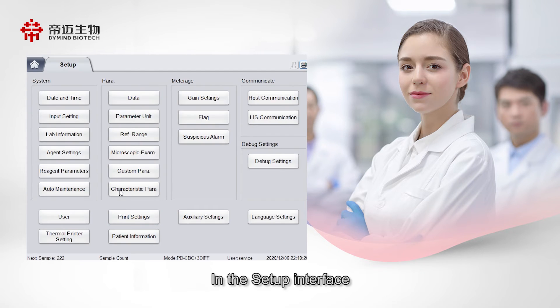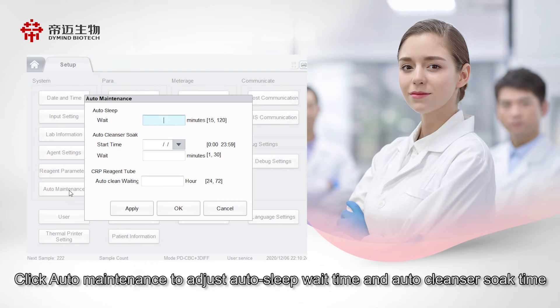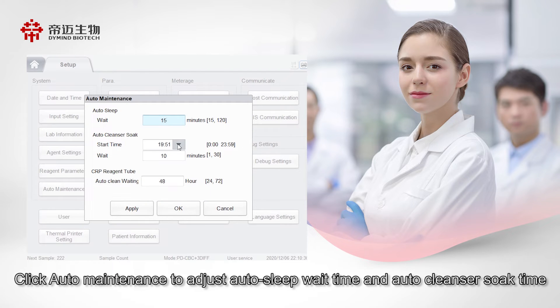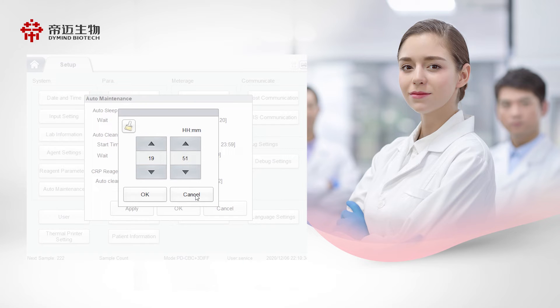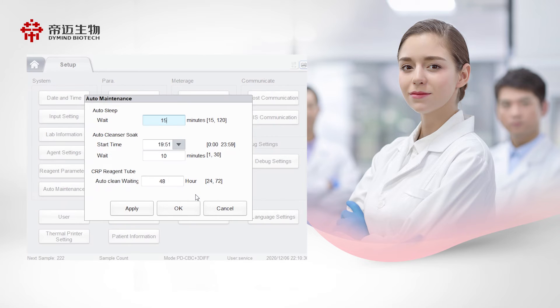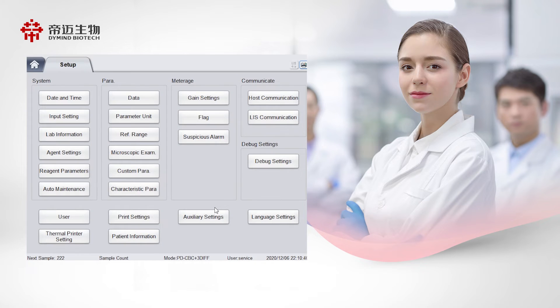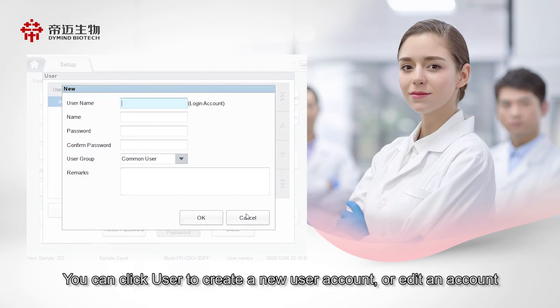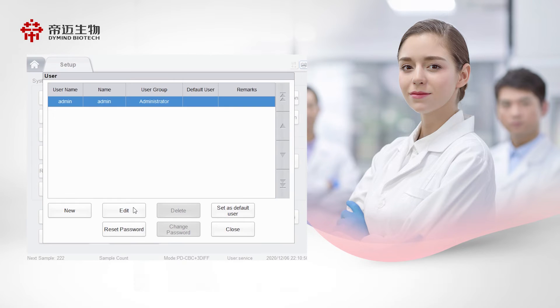In the setup interface, click Auto Maintenance to adjust the Auto Sleep Wait Time and Auto Cleanser Soap Time. You can also click User to create a new user account or edit an existing account.